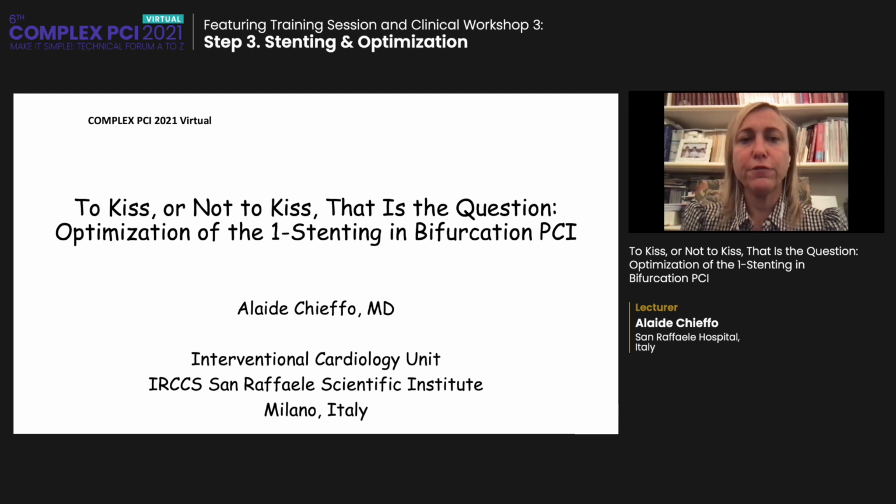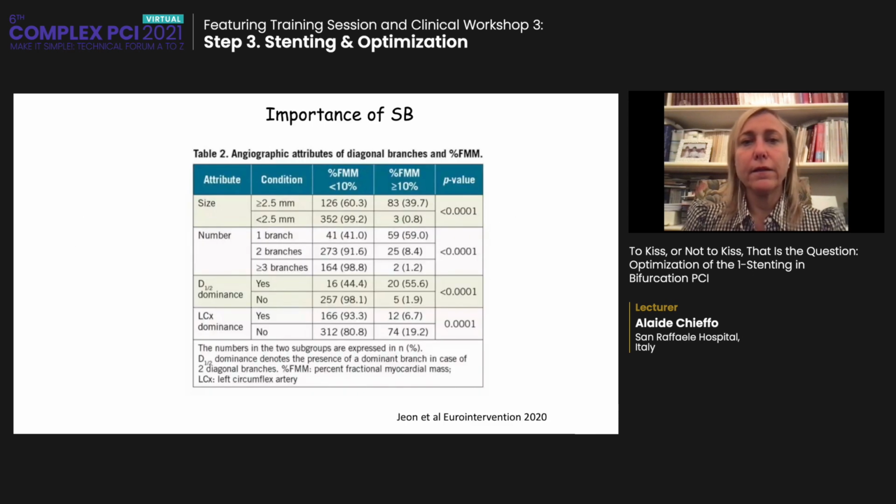I'm Ali De Cheffo from Raffaele Scientific Institute, and I'm going to talk regarding the usage of kissing balloon inflation and in general optimization of provisional stenting. In the decision making of the technique to be used, the importance of the side branch is crucial.